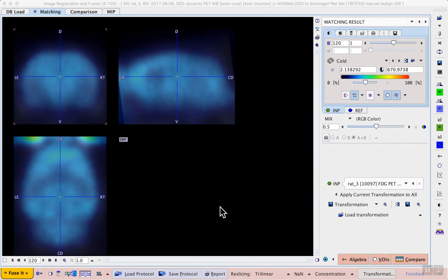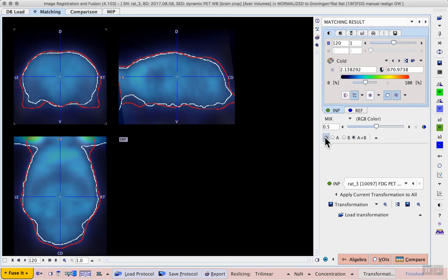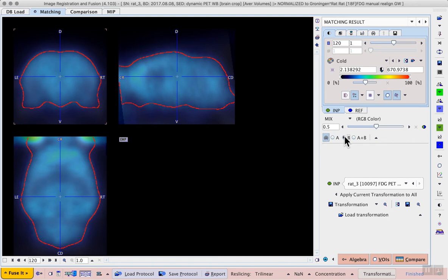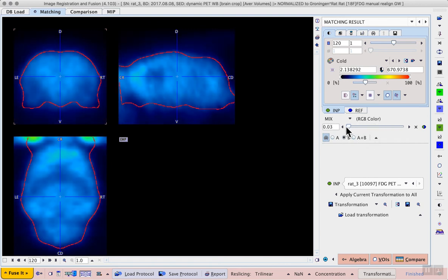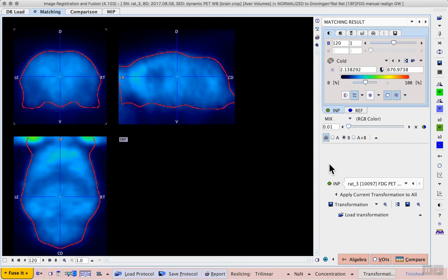Once the calculations are complete, we can assess the result using the Fusion controls. Creating a contour for the outline of the template and comparing it to the normalized individual is often helpful. We can do this using the Contours button in the Fusion controls, selecting only B for the template, and then using the Fusion slider to display only our individual data. In this case, the result is acceptable. So we can save the transformation to the database to avoid having to repeat the calculations if we reanalyze this animal.